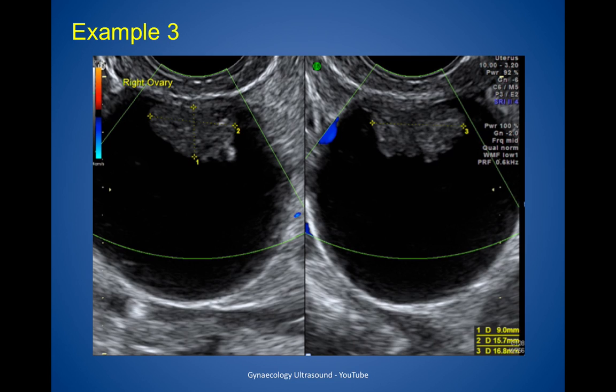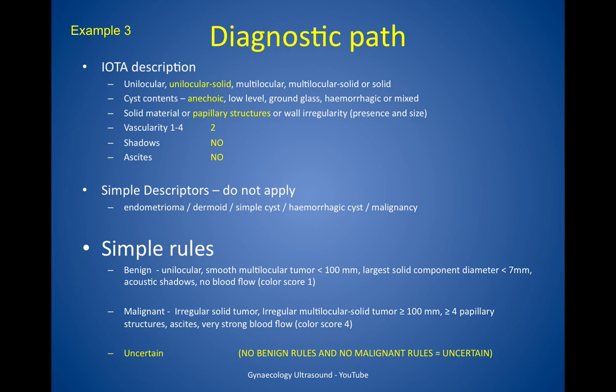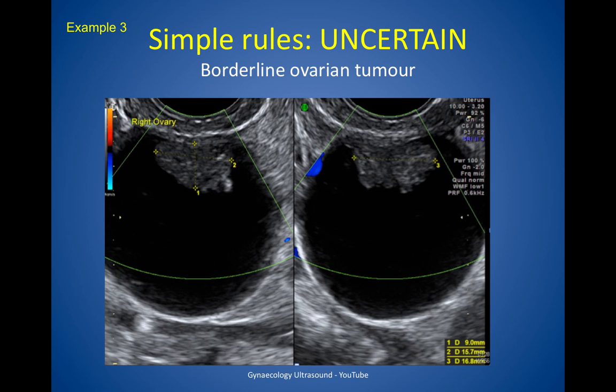Here's another example. In description this is unilocular solid — a unilocular lesion with some solid material — and there was one papillary structure, some vascularity, no shadowing and no ascites. It's not obvious on simple descriptors. On simple rules there are no benign features and no malignant features, so it's uncertain. This was a borderline ovarian tumour.